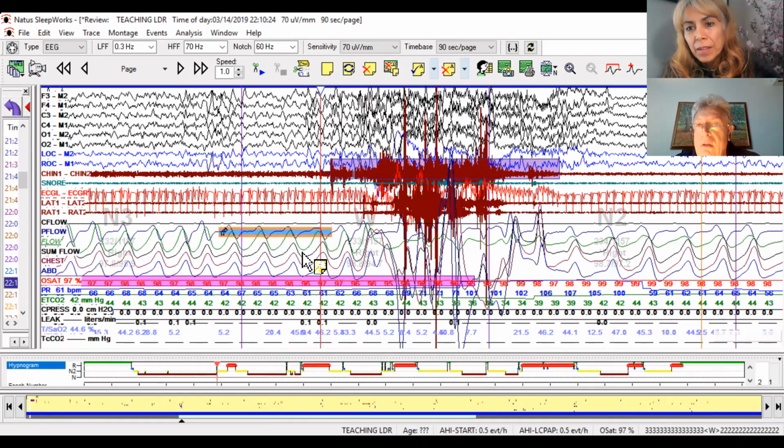This is not demonstrated at all. My personal idea, but supported by data also, is that they tend to synchronize because they are embedded in the same oscillatory pattern, but they can occur by themselves. So my idea is to count them always to indicate the association, the same as you do with the arousal.